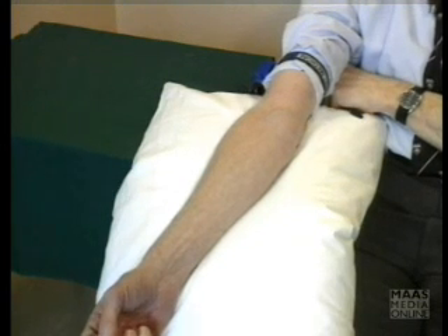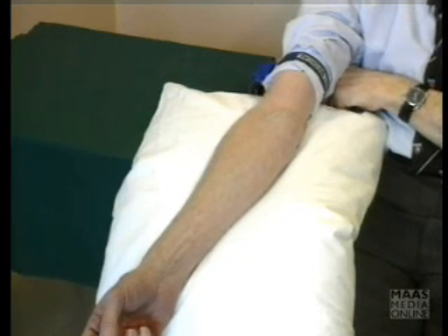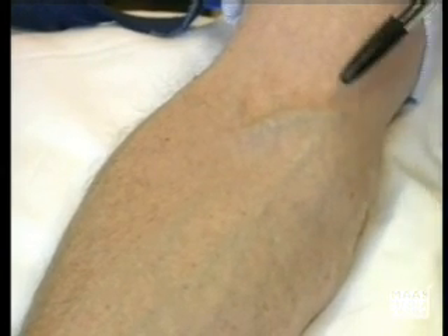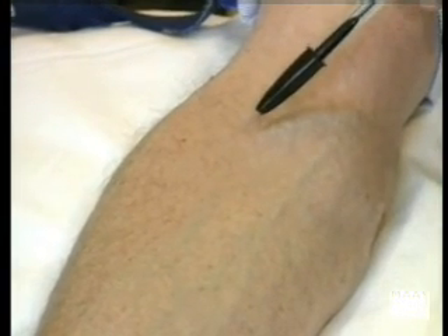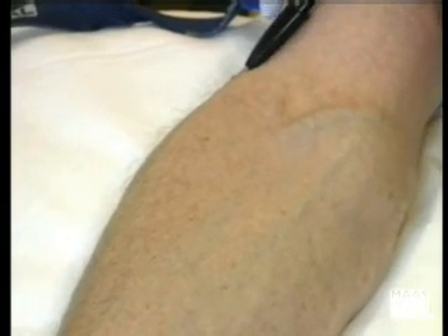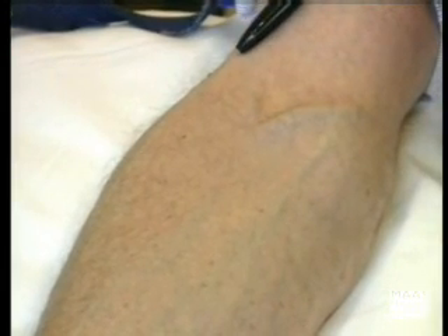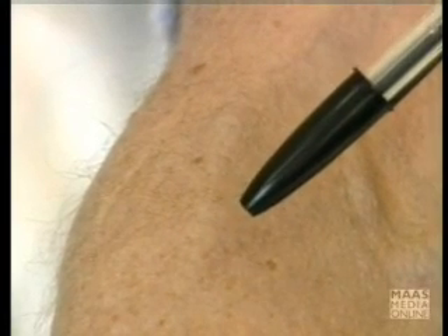Now, I do have a tourniquet on my arm already, and I want to point out the most useful veins for collecting blood. There are three veins in the antecubital fossa which are ideal for collecting blood. The two best ones are the median cubital vein, which goes into the basilic. There's also the vein which joins the median cubital to the cephalic vein, and many people actually prefer this vein because it is well fixed.